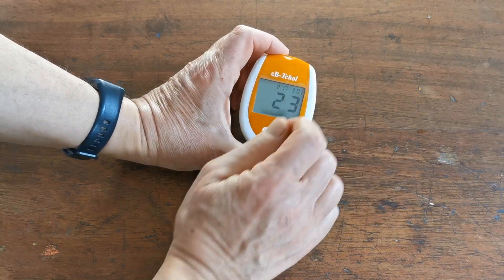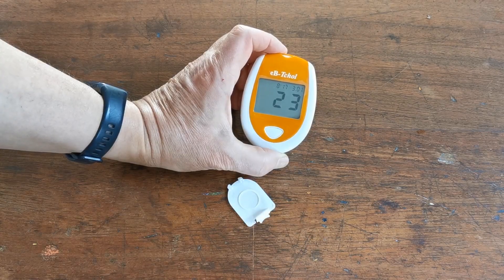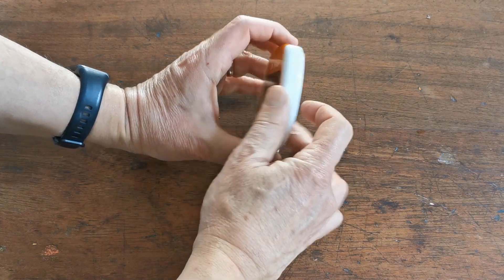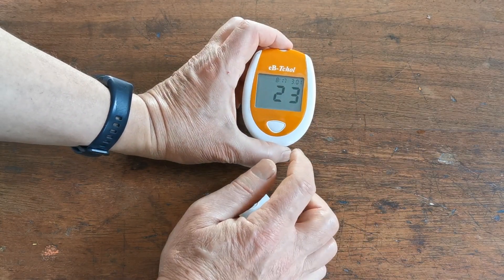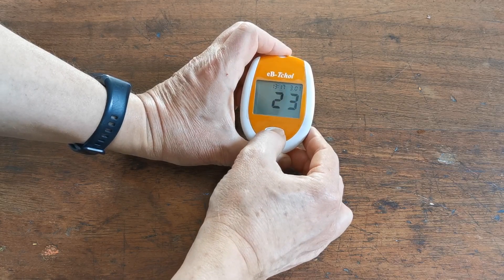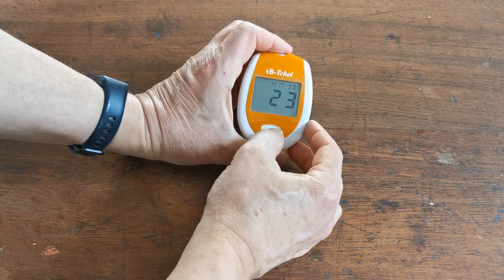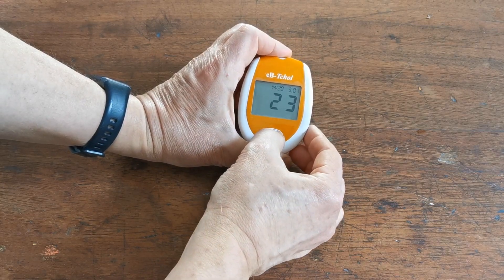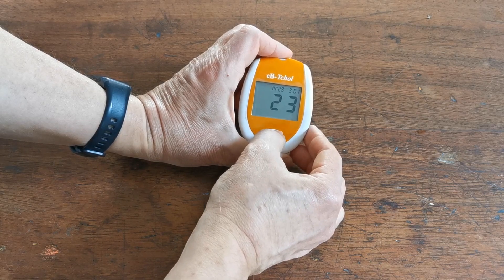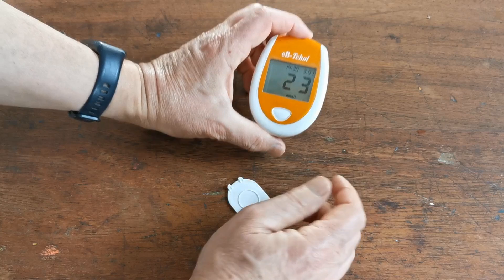Now it's asking for the day of the month. It's actually the 1st of March, so I'm not going to press the button, but you can select right the way through to the correct day. When you're happy with that, press again, and it's asking for the time. This is a 24-hour clock, so we're at 14:30.